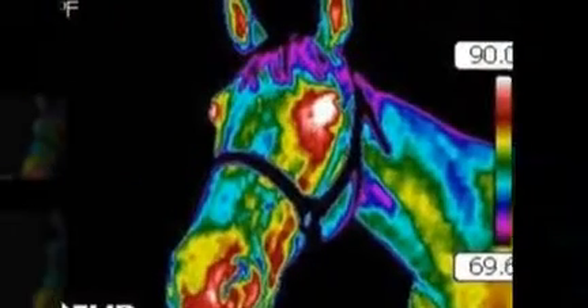Uses of equine thermography include hoofs, tendons, ligaments, joints, back and muscular conditions, saddle fit, and dynamic examinations using the high-speed treadmill.